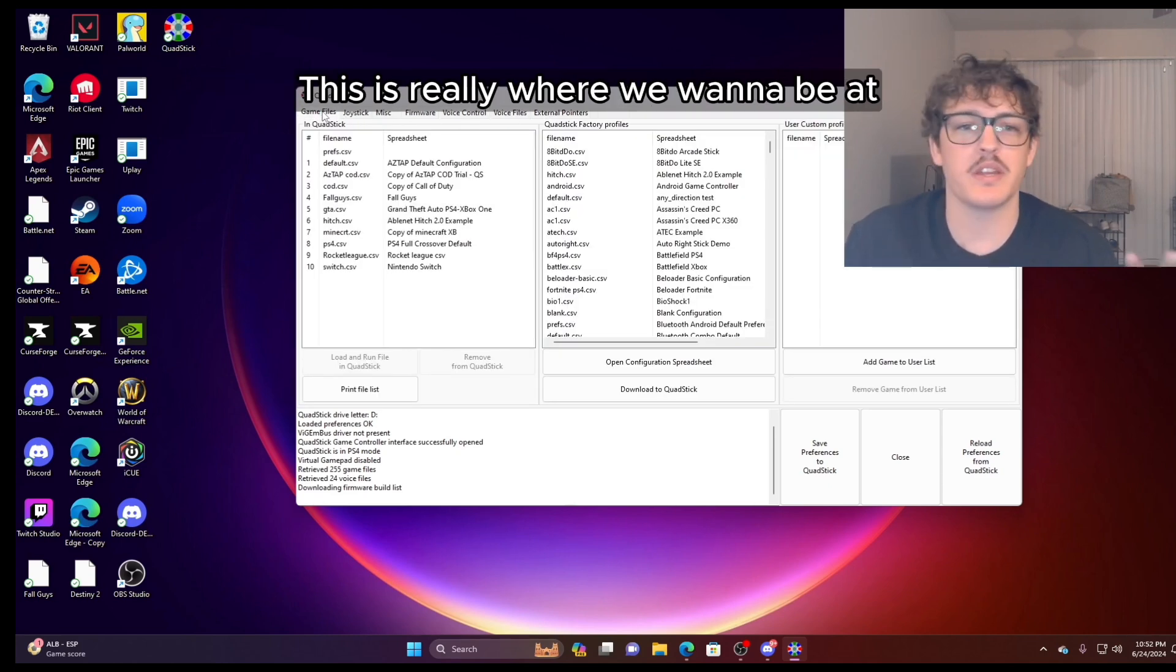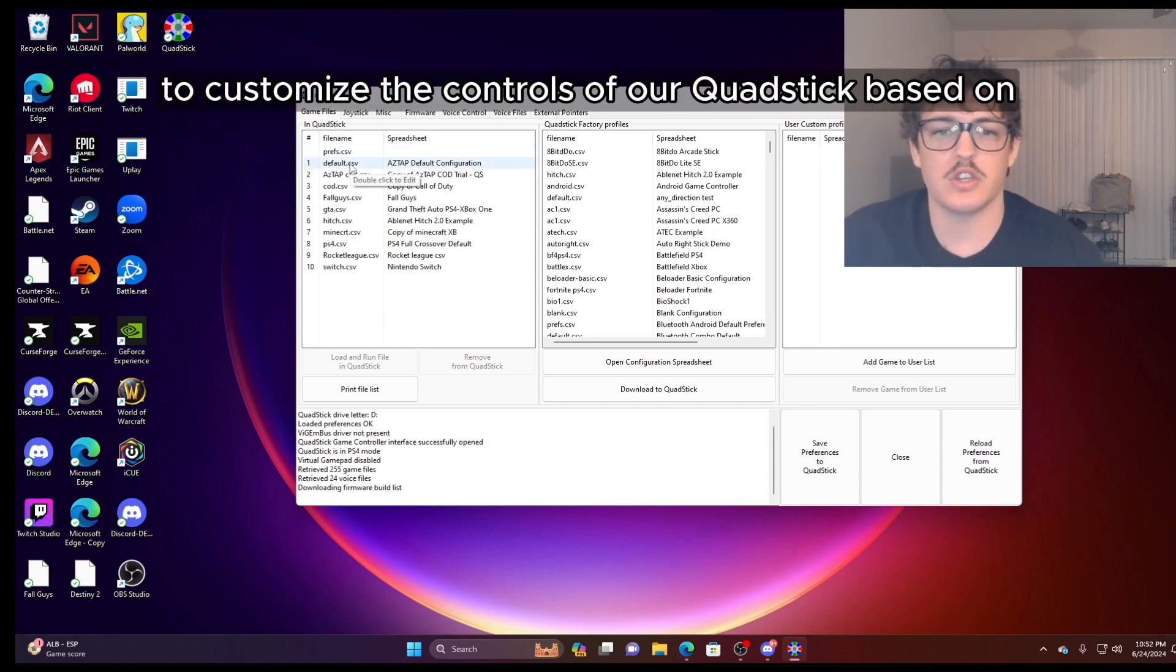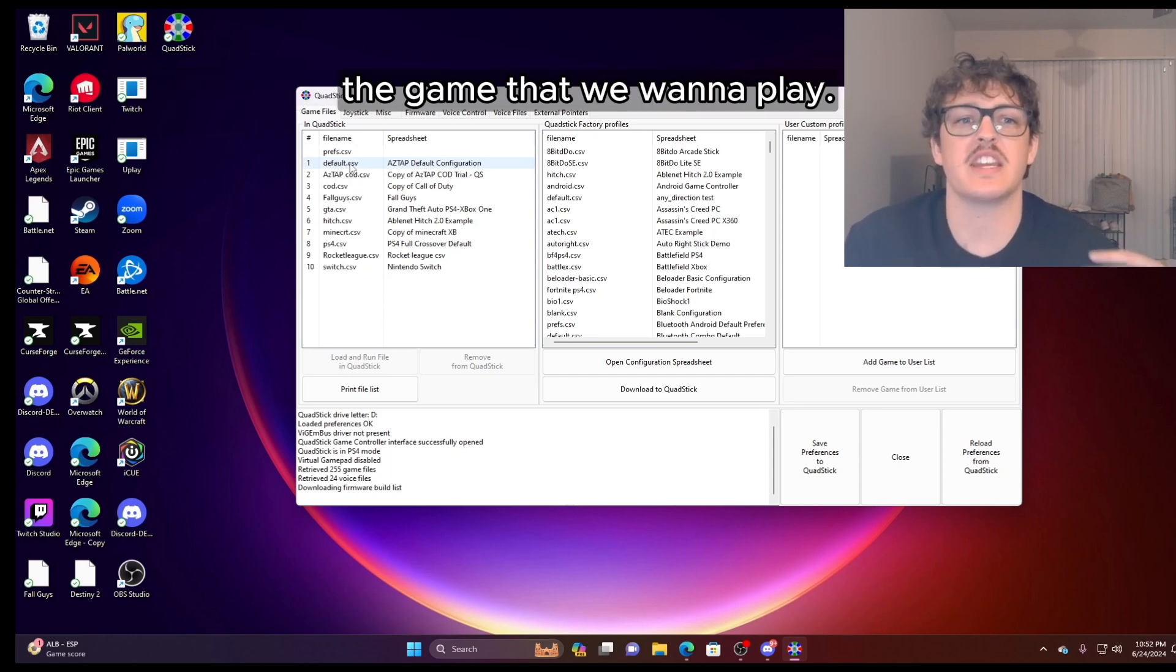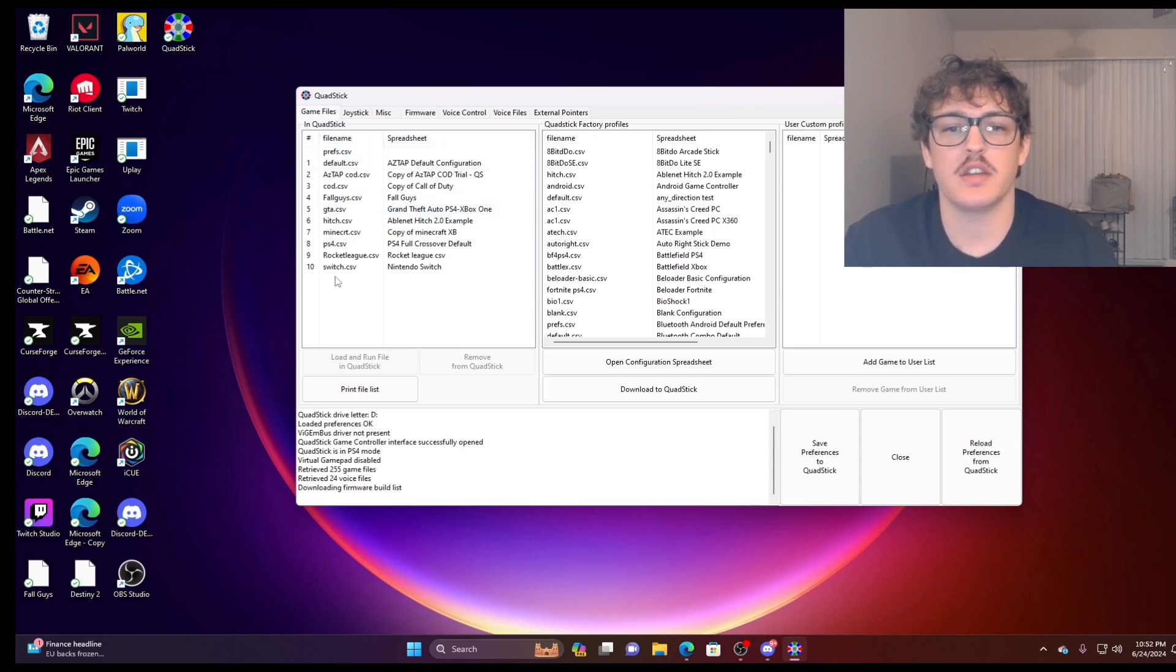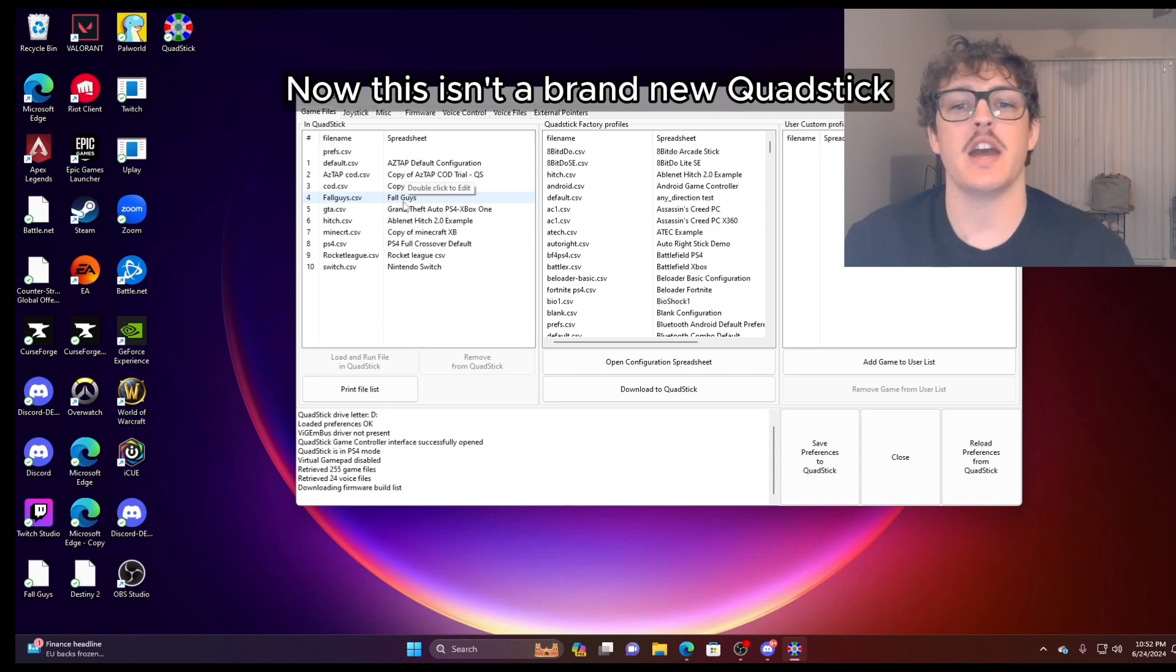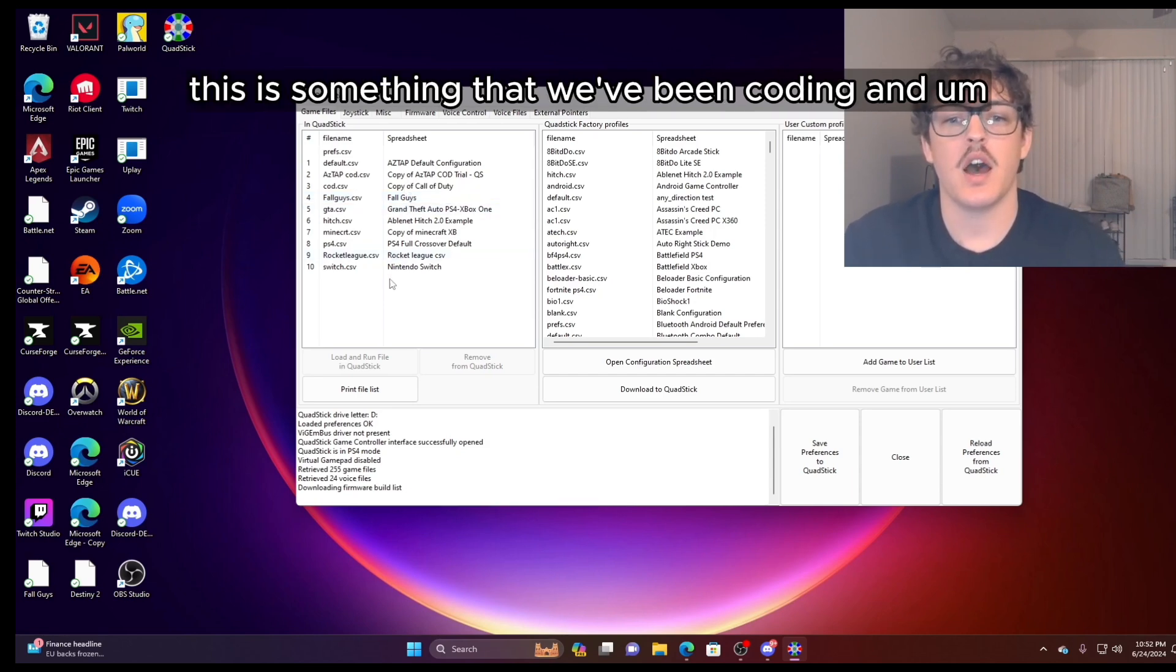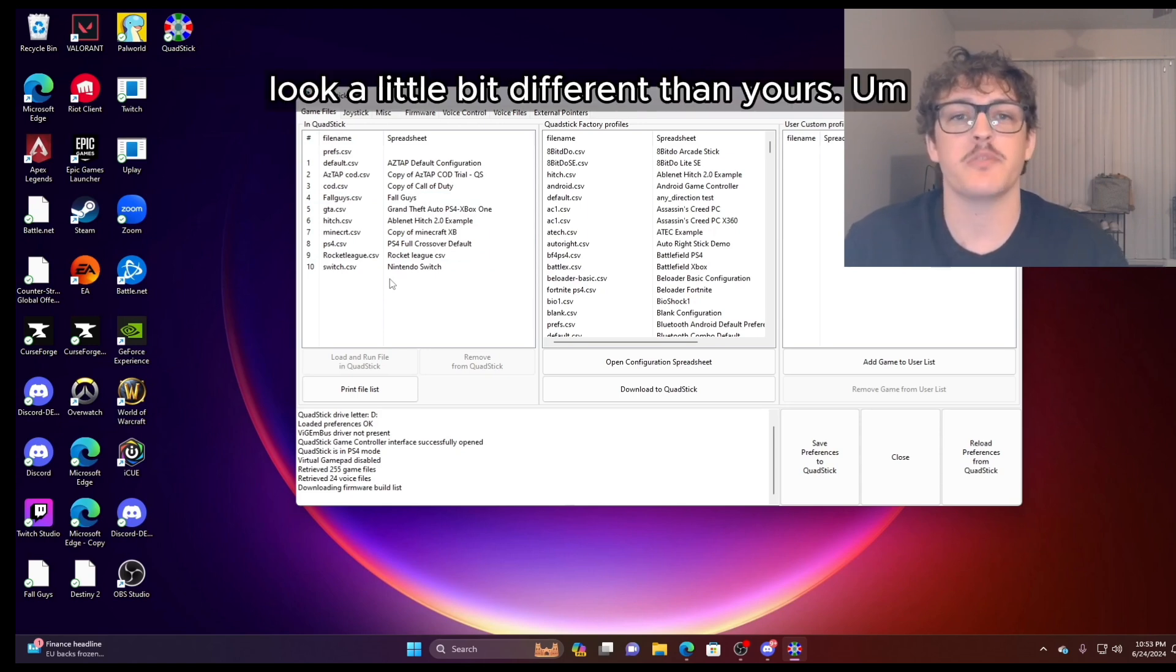This is really where we want to be at. This is going to allow us to customize the controls of our QuadStick based on the game that we want to play. In the games file tab, this first box here will show all the different profiles that we have loaded on our QuadStick. Now this isn't a brand new QuadStick. This is something that we've been coding and messing with over the past few weeks. So our profiles will look a little bit different than yours.